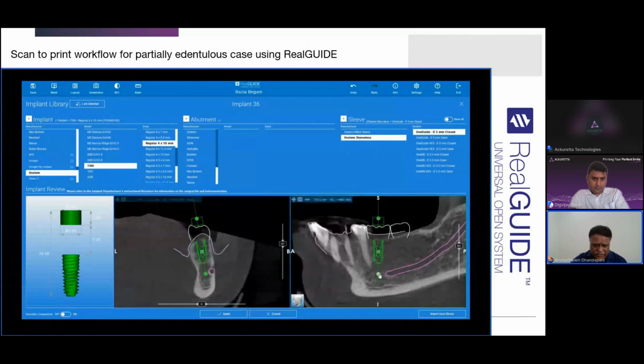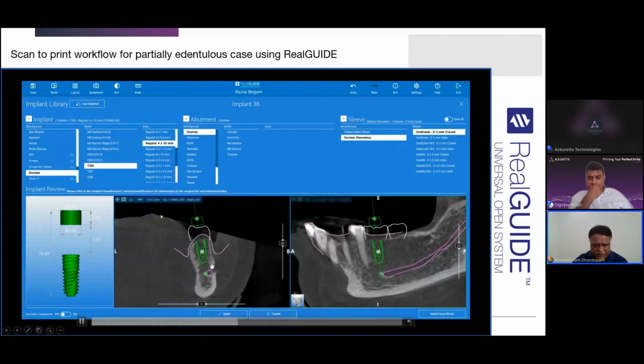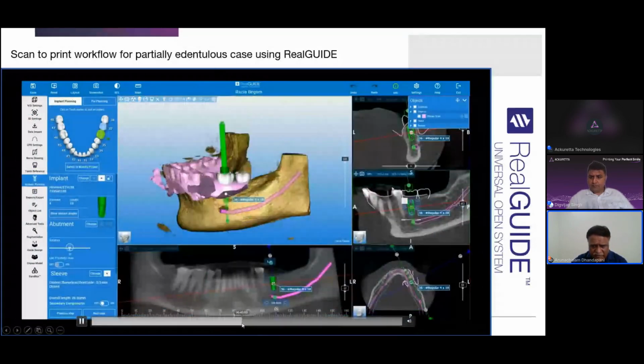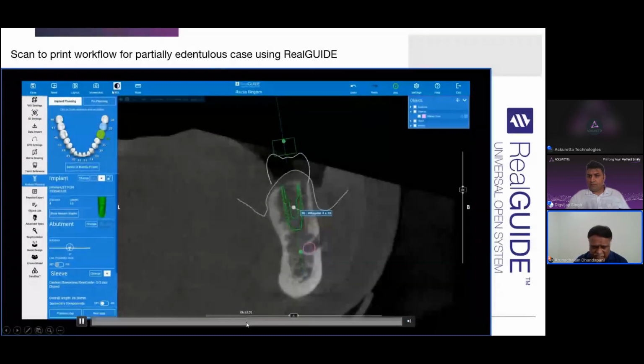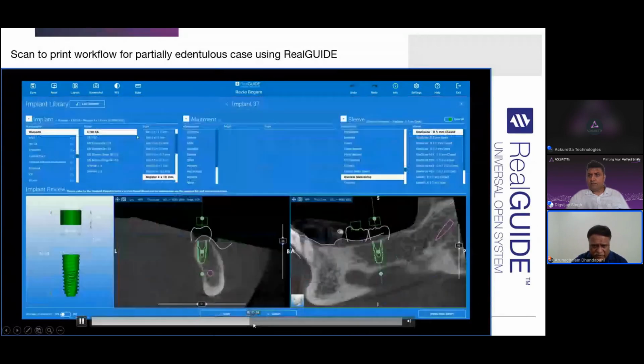Here you see that we've tried a 10 millimeter implant, and we'll see how you can orient it appropriately, keeping the appropriate distances from the adjacent tooth. You can then try changing it into a 12 millimeter implant, and when we do that, we begin to see that maybe we can move it. This is a 4x10, so we can position it wherever you want. We can plug and play different dimensions of implants, and that will help us select an appropriate diameter. So we can keep that inventory with us when we are working on the case.